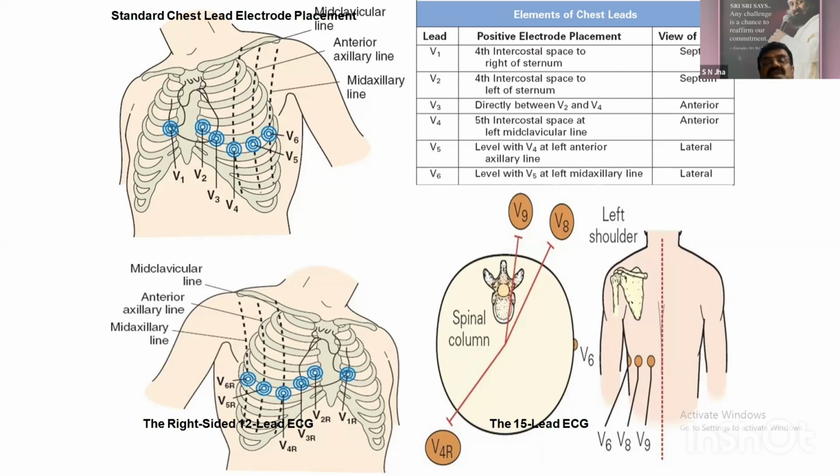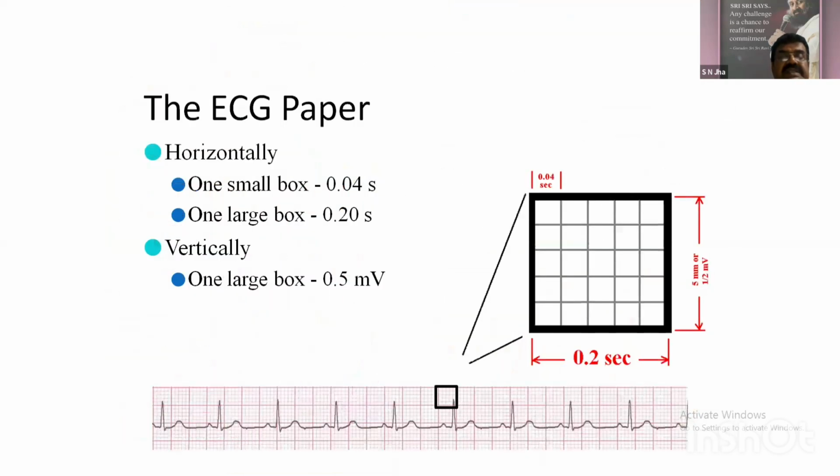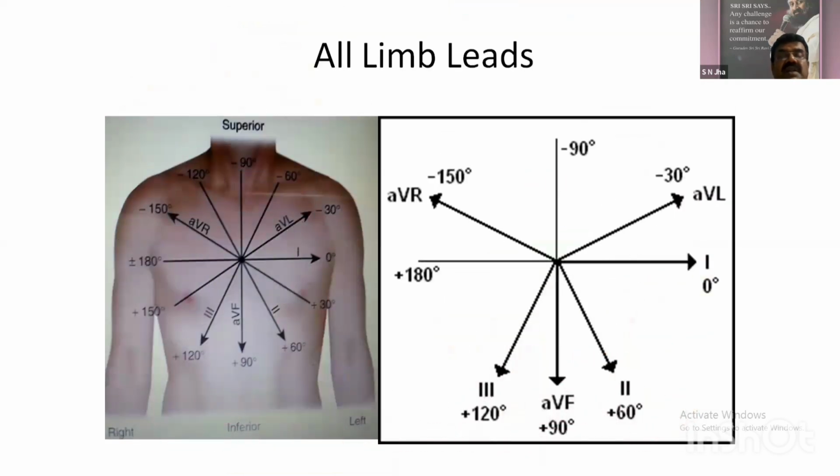So what are the positions? It is written there, and you need to do it. I request you to go and do some ECGs by your own hands, then you will understand properly. This we have discussed. Now the limb leads.